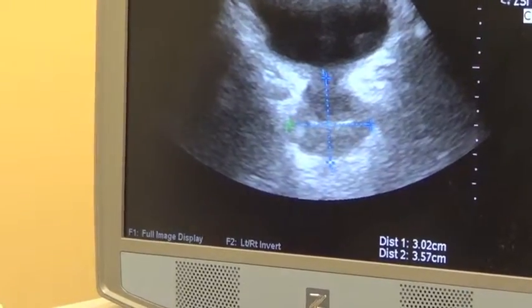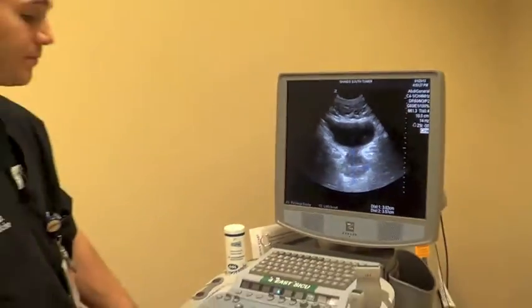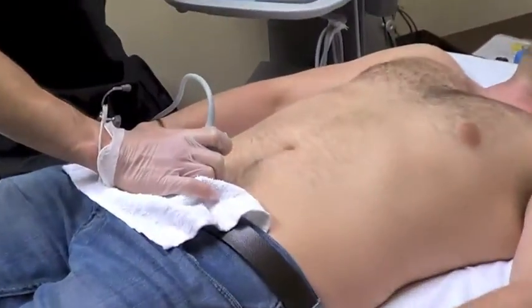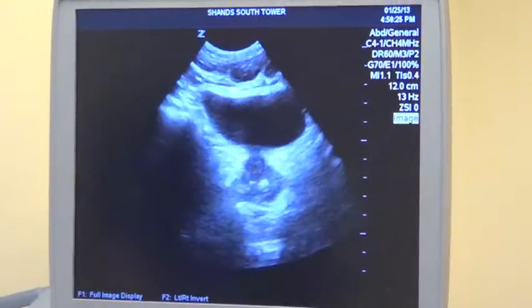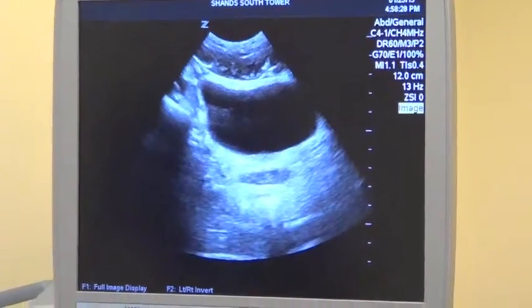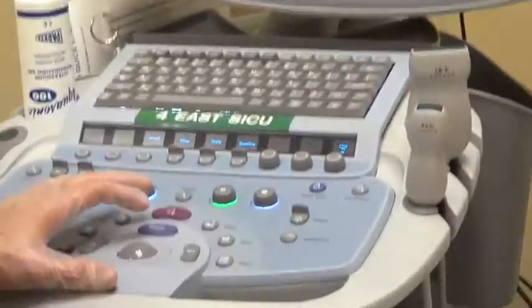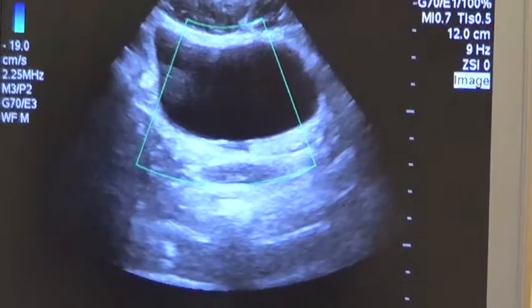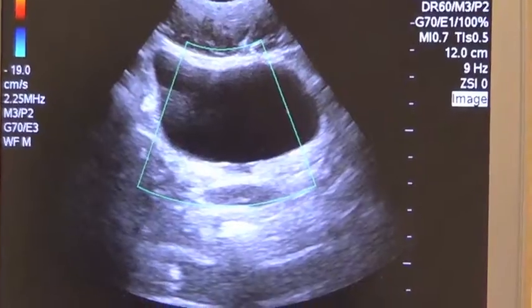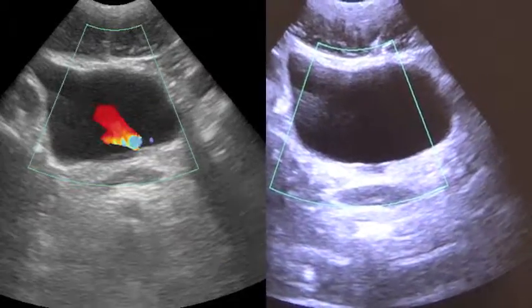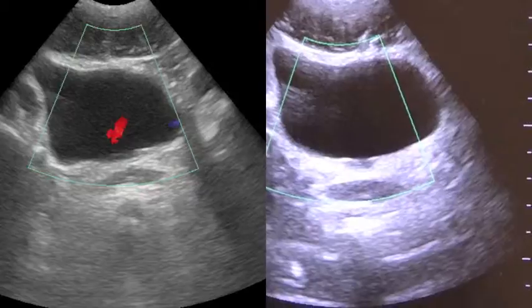This is a normal prostate with approximately 3 by 3.5 centimeter diameter. Finally, we can supplement our understanding of ureteral obstruction with color flow. We look at the base of the bladder, just above the prostate where the ureteral jets typically are present. We turn on color, move the color window over the base of the bladder, and then wait to ensure that there are bilateral ureteral jets and therefore no obstruction on either side.